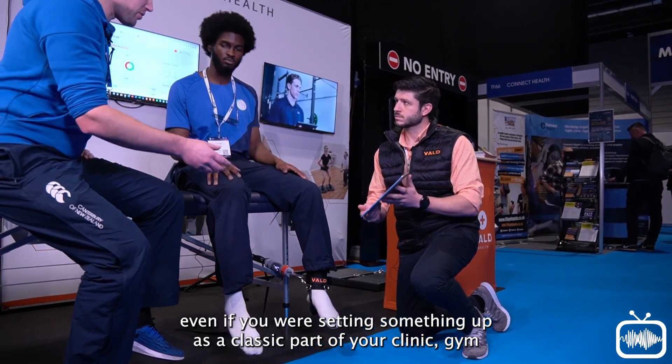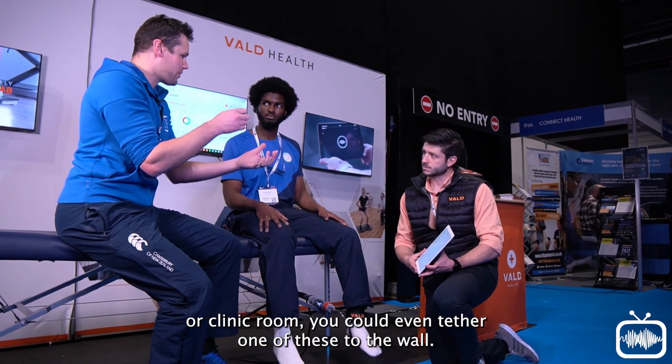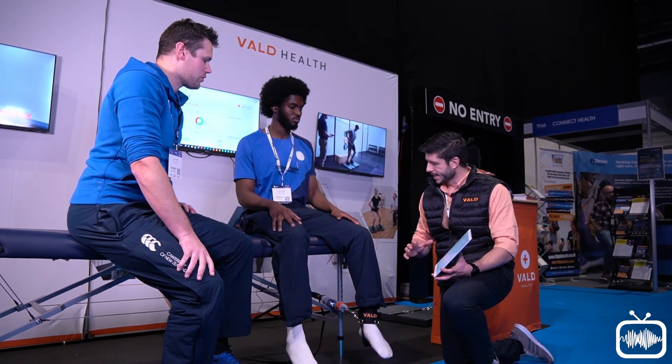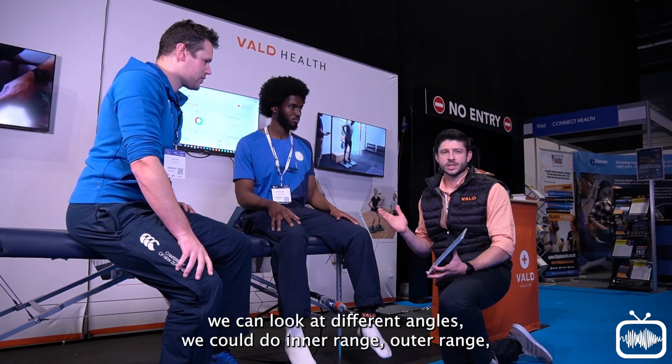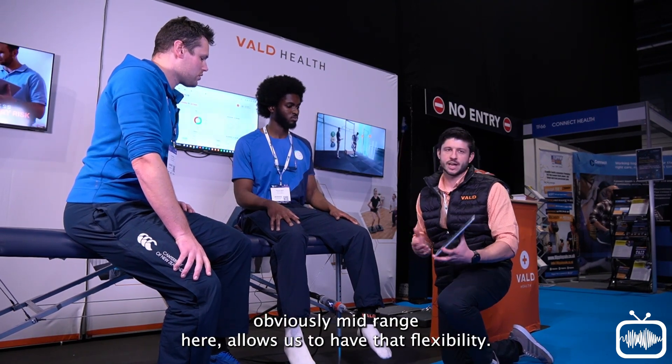Even if you were setting something up as a classic part of your clinic or gym room, you could tether one of these to the wall. Wall bars work really well for upper body testing as well. What's really nice is that because we can set different angles, we could do inner range, outer range, obviously mid range here — that allows us to have real flexibility.